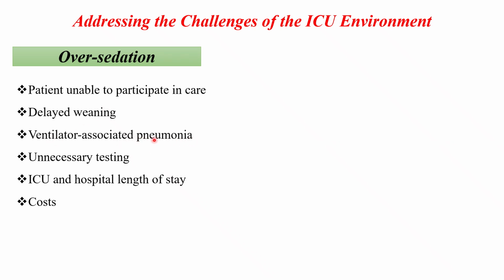So longer ventilation due to over sedation increases infection risk. Unnecessary testing: a sedated patient may undergo extra diagnostic procedures due to unclear clinical status. And increased cost: extended ICU stays and complications raise treatment expenses.